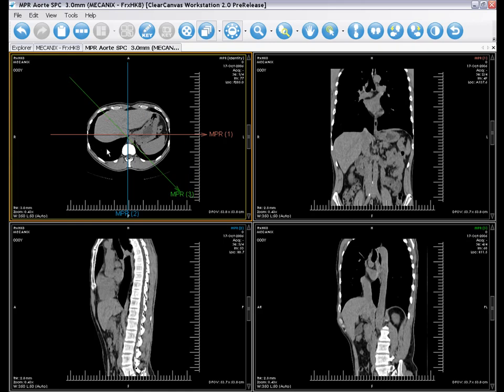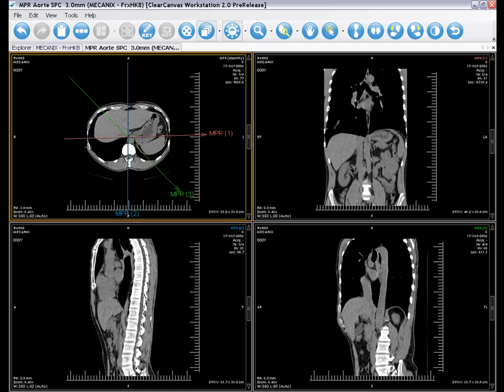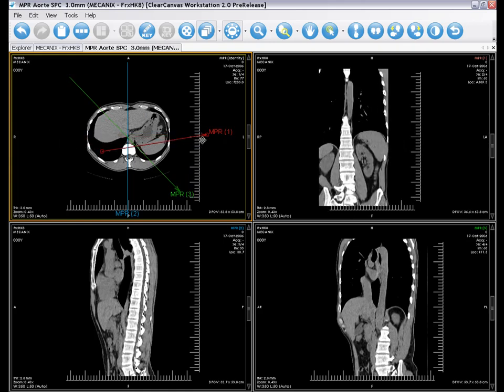Each line is easily adjustable by clicking on the endpoint and resizing and repositioning the line.